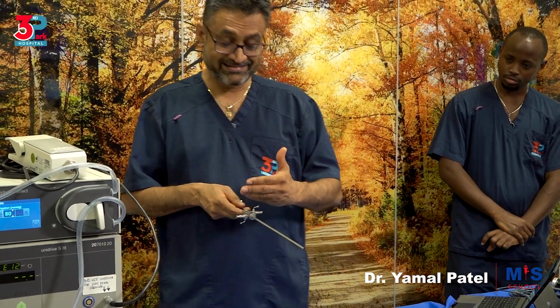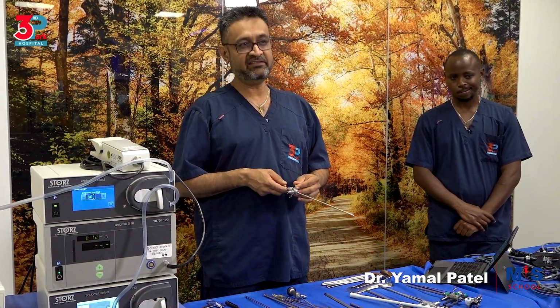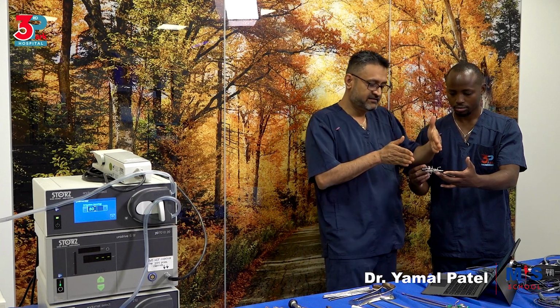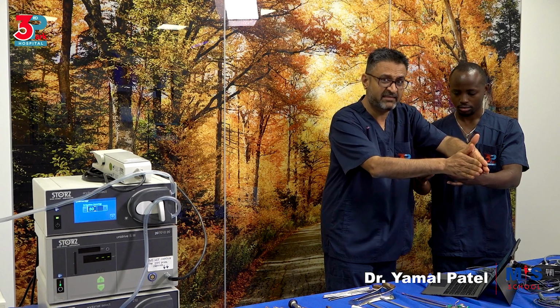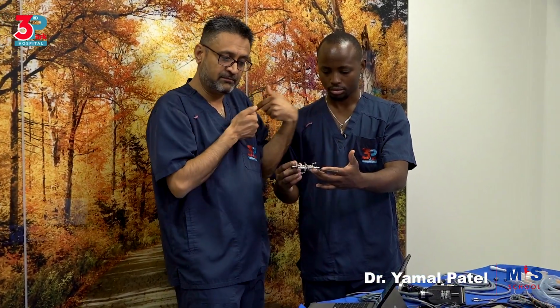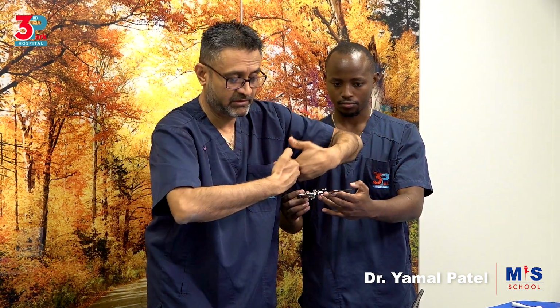Now, the next thing, why can't we interchange this? It's important not to interchange this, not because it's posing danger to the patient, but when you connect the in, remember fluid will be flowing in like this, and then going out through the fenestrations back. So reverse that and see what happens. The fluid goes out through the fenestrations and in through the center one, out this way. So it will go this way and come back this way.